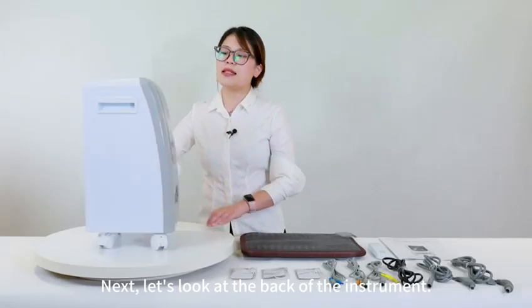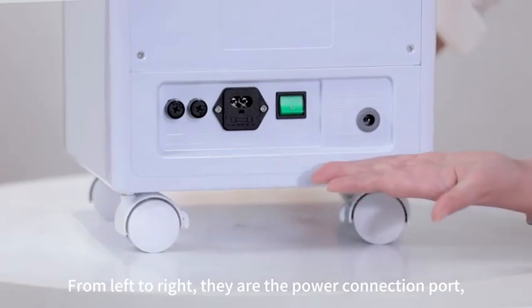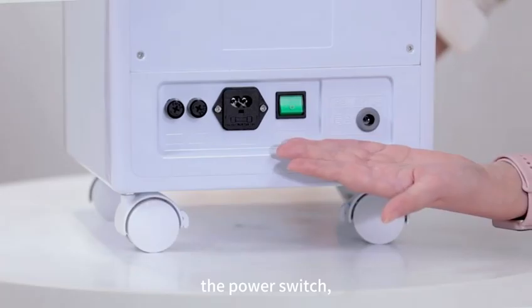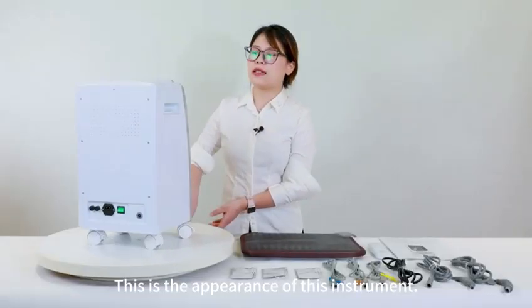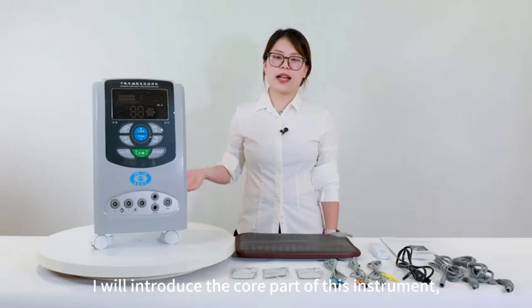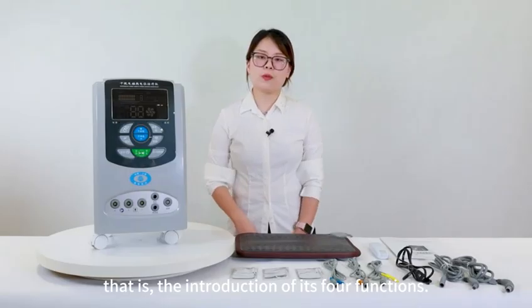Next, let's look at the back of the instrument. From left to right, they are the power connection port, the power switch, and the connection port for local treatment. This is the appearance of this instrument. Next, I will introduce the core part of this instrument, that is, the introduction of its 4 functions.